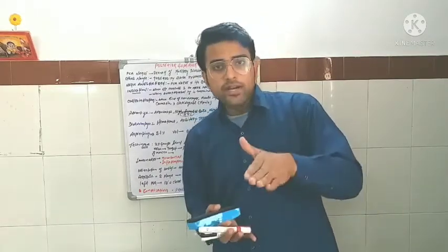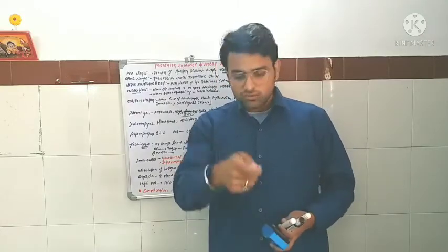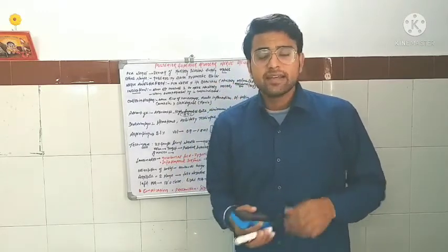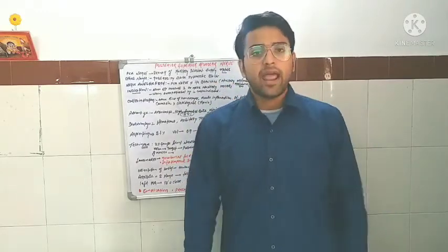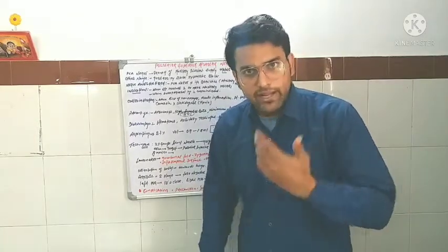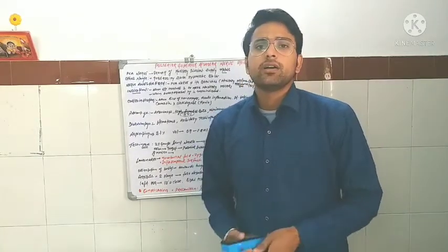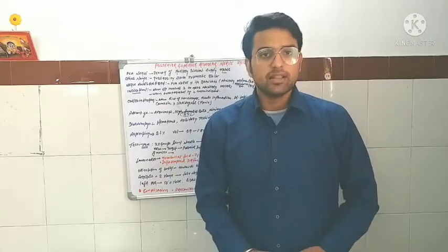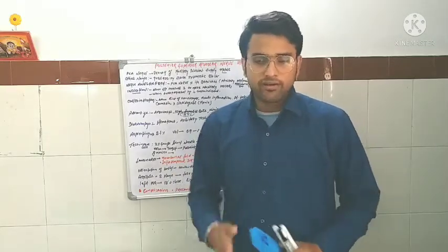So after rotating in the second plane, it can be positive, and at that time we need to just take out the needle from that side and apply pressure there. We will tell the patient that we will do the exodontia after some days because it will take some time to heal. This is not a right block.